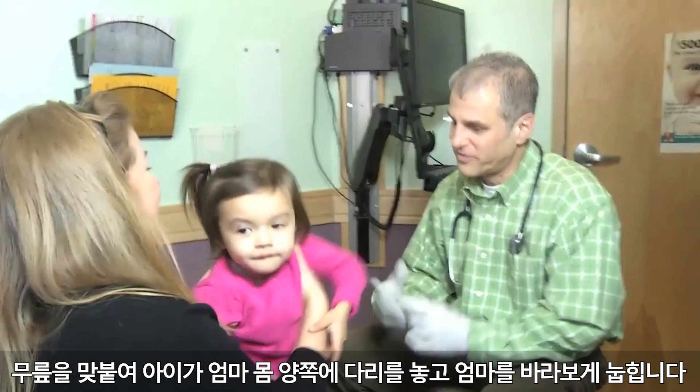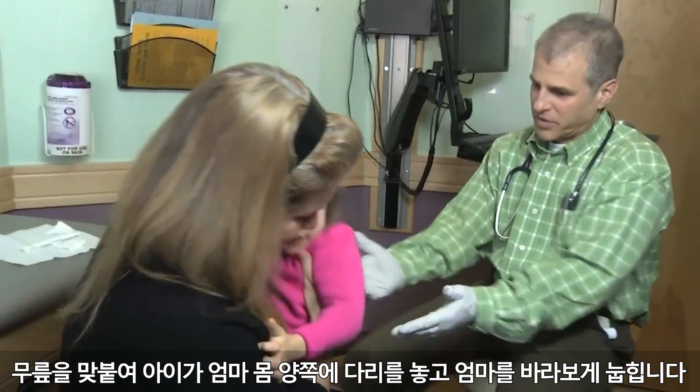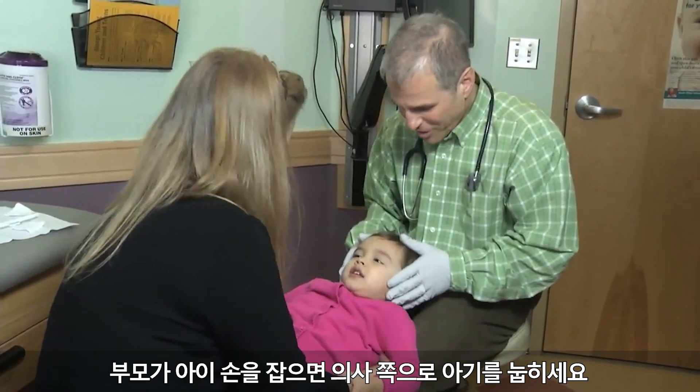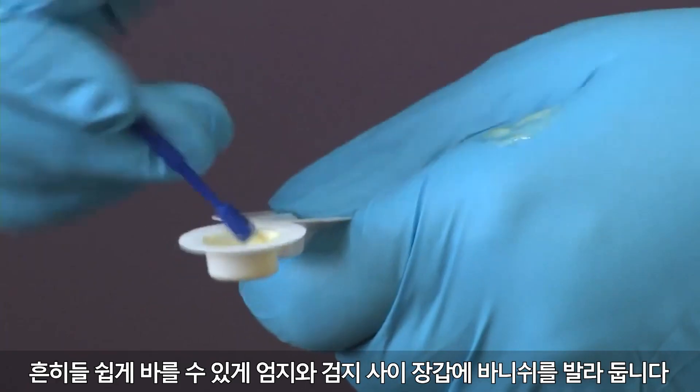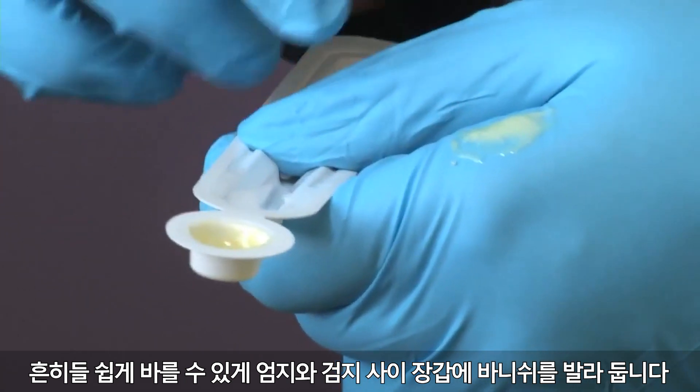Use the knee-to-knee position. Start with the child facing the parent with her legs on either side of mom's torso. Have the child recline toward you as the parent helps by holding the child's hands. Many providers will put the varnish on their glove between their thumb and forefinger for easy access.